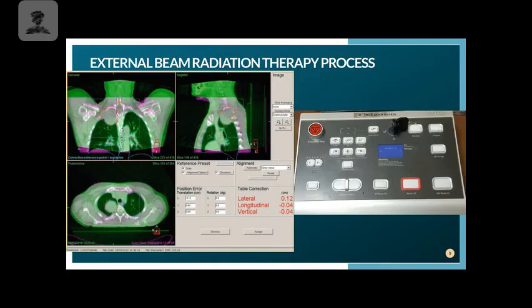Over here, we do have where you can increase the audio, the sound from the patient. If you thought that they said something, you can increase the volume. You also have this push to talk with Varian, the manufacturer, which allows you to hit that button and it will project your voice into the room. Occasionally, we do have to have them hold their breath. With that, you're going to have to hit the button and tell them because you're not in the room with them.